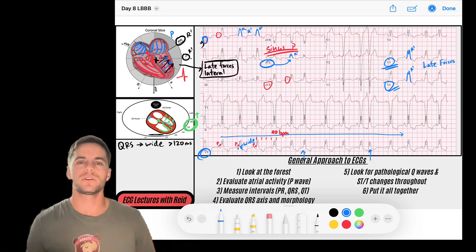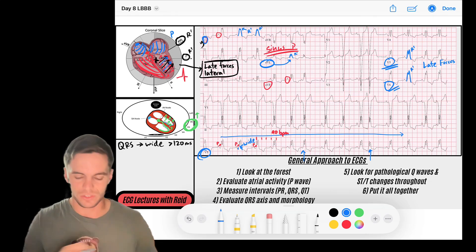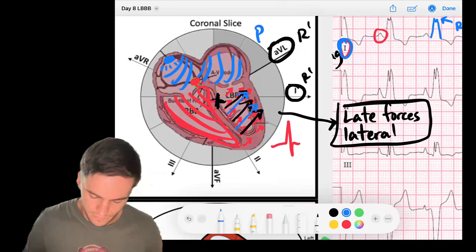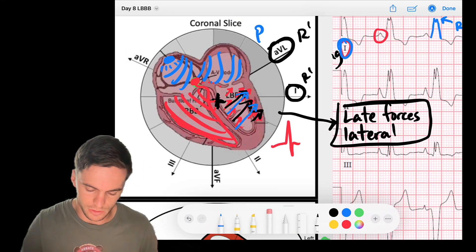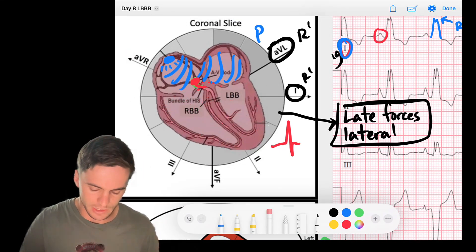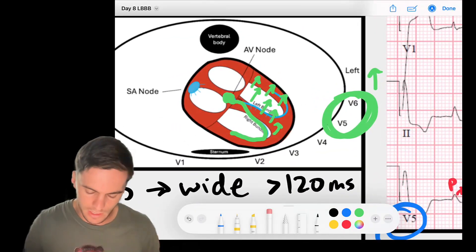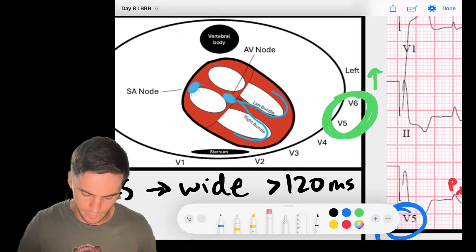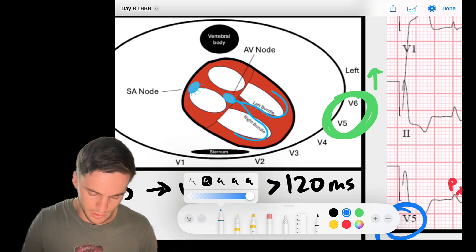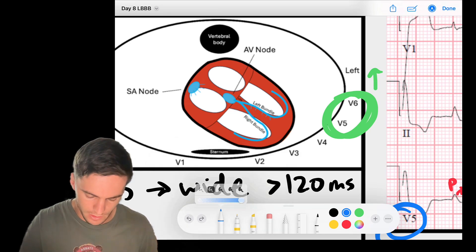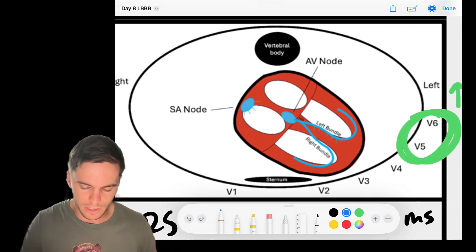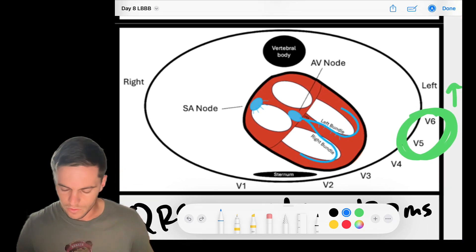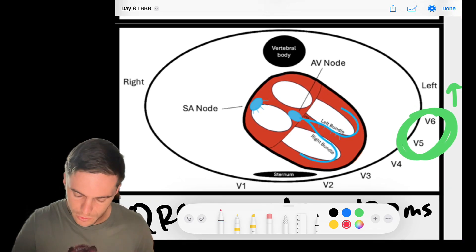Now there's one more concept that I want to talk to you about with a left bundle branch block that I think is just fascinating. So in normal ventricular depolarization, we're going to come here. In normal ventricular depolarization, if I zoom in on my transverse leads, notice that the interventricular septum, kind of highlighting in red, that's my interventricular septum.